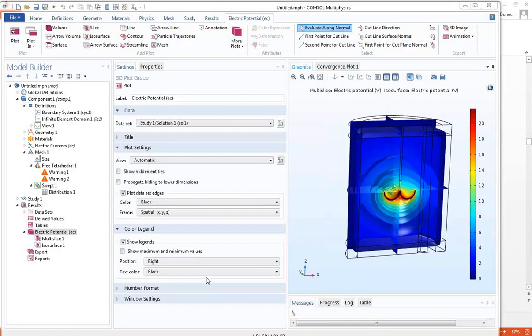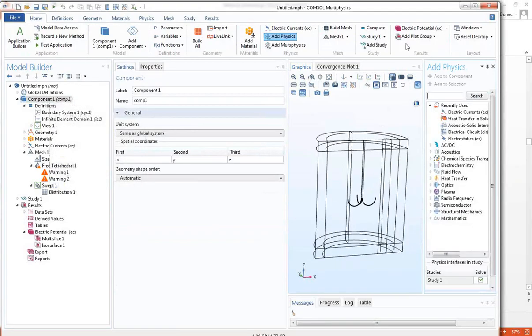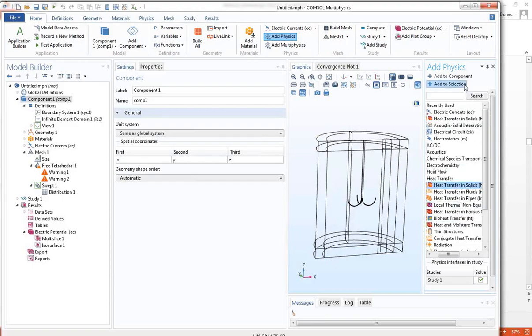So with that, given that I had to do a little bit of a correction, let me continue. Let's change this to an honest-to-goodness frequency analysis. Wait a minute. No, I've got to add some heat. So let's add a physics. So I'm going to right-click on a component, and I'll add a physics. Let me move this question-answer pane a little bit out of the way. And then I'm going to go in and add heat transfer, and I'll add either heat transfer in solids or bioheat. In this case, I'll do heat transfer in solids and add that to the component.